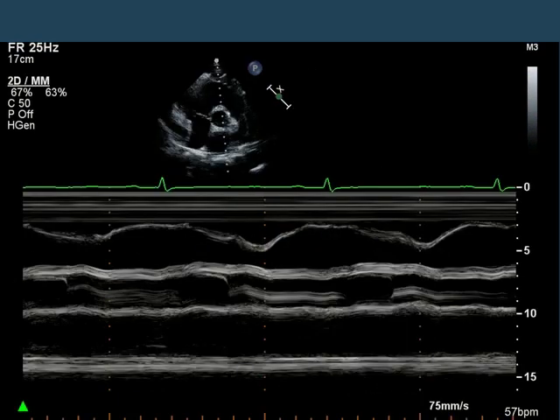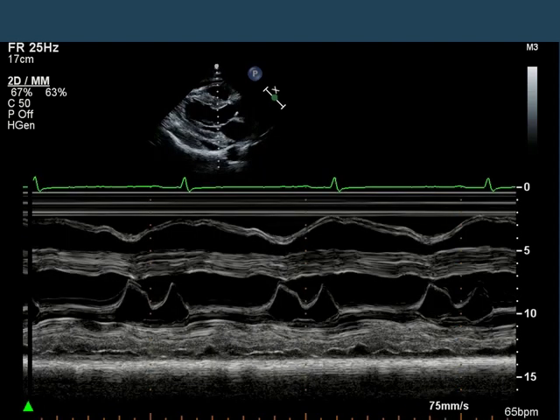You can see these findings on M-mode. Here we have an M-mode for the aortic valve. You'll notice that after the aortic valve closes, the tricuspid valve should be opening up and the RV should be getting bigger. But there is a bit of a delay between when the aortic valve closes and when the RVOT starts expanding. In the next slide, you can see something similar in the mitral M-mode. You'll notice that after the mitral valve opens, there's a bit of a delay before the RVOT starts to get bigger.